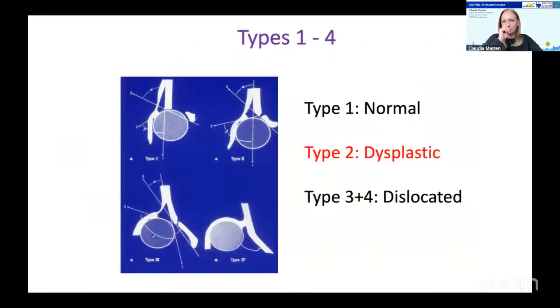We have the 4 hip types, as you heard. We have the normal hips, we have the dysplastic hips, and we have the dislocated hips that we describe. Important because it's standardized, and with my long explanation about the types and about measurements, we know that the dysplastic group of hips are centered still, and also stable. It's important that you take on board that this gray area, which in other techniques is not clearly identified, is where the trouble comes in making a call on whether a treatment is initiated or not.